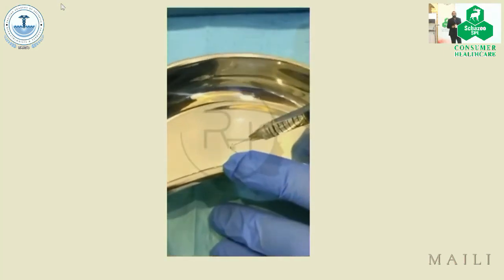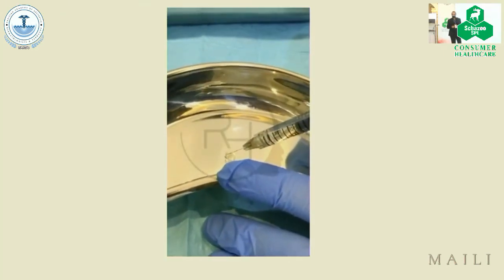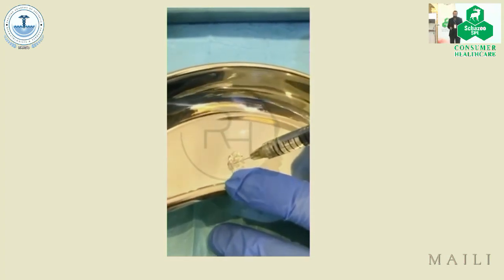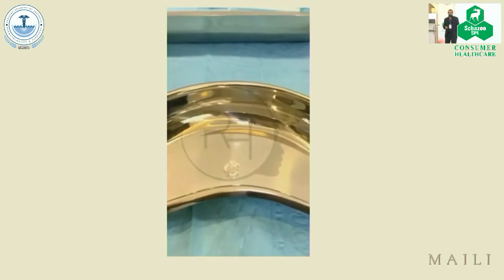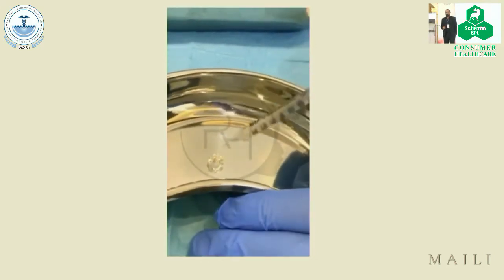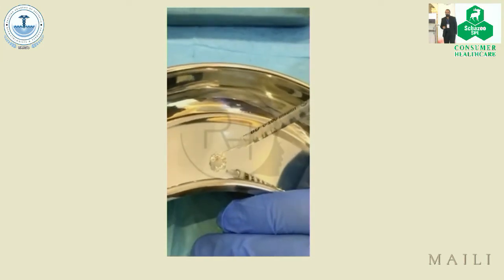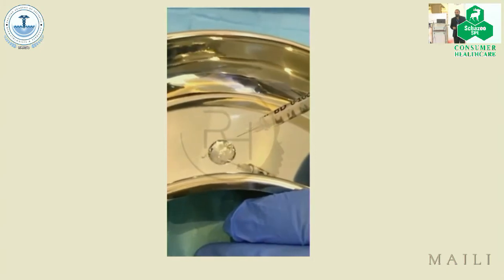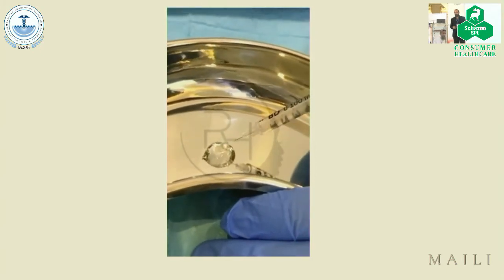Now, this is how hyaluronidase works. So this is hyaluronic acid being placed. And this is something for you to think about when you want to use hyaluronidase. You don't just inject it. After placing the hyaluronic acid, I'm now placing the hyaluronidase over it. It does dissolve rapidly. This is the beauty of it. But you can still see particles.